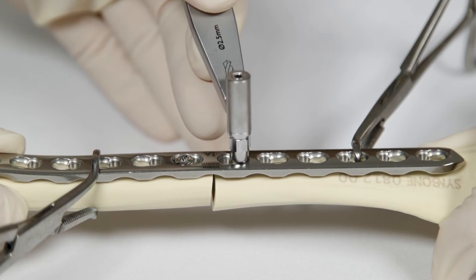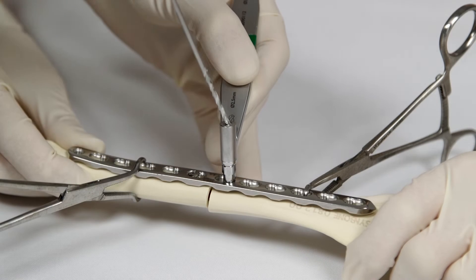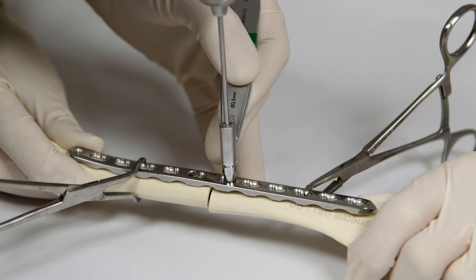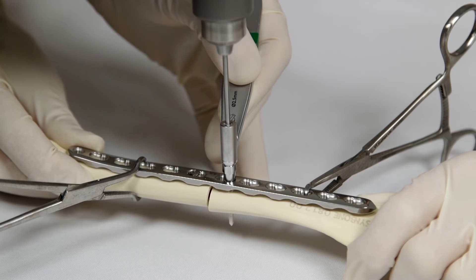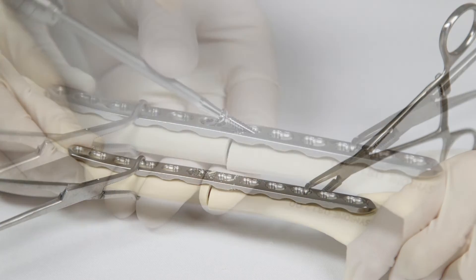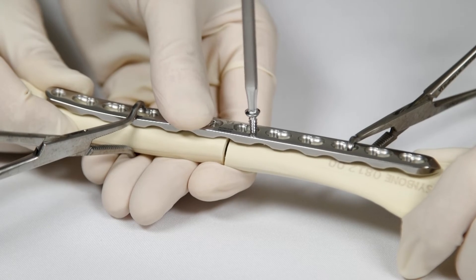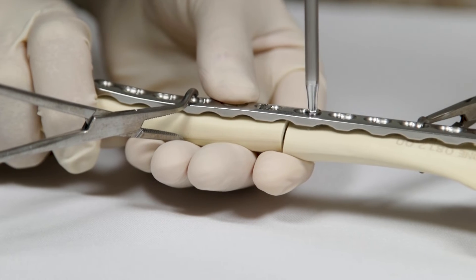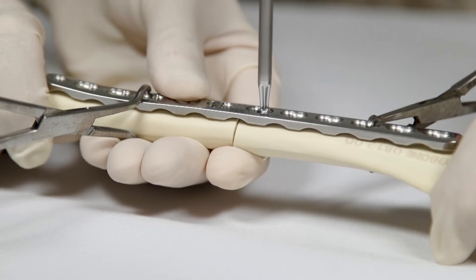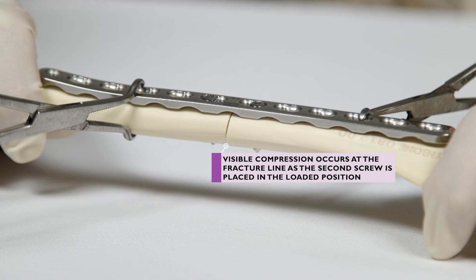The second non-locking cortical screw is placed in compression mode on the other side of the fracture. The universal drill guide is not pressed down but is held against the edge of the oval plate hole to achieve loaded pilot hole positioning. As this screw is tightened, the screw head slides down the slope of the oval plate hole, travelling towards the centre of the plate. Because the screw thread is engaging the bone as the screw head moves, it causes the bone to move towards the centre of the plate and towards the other bone fragment, creating axial compression across the fracture.